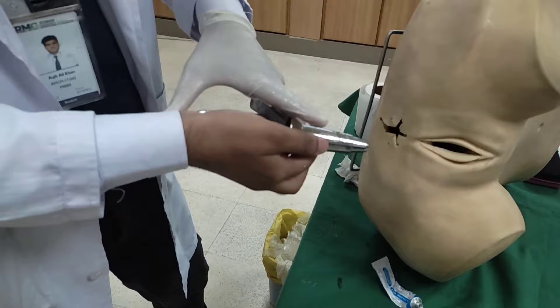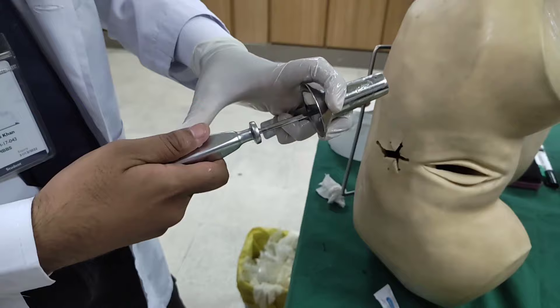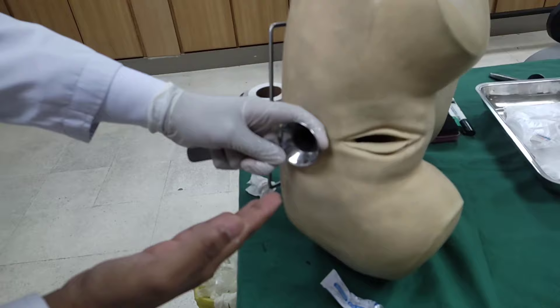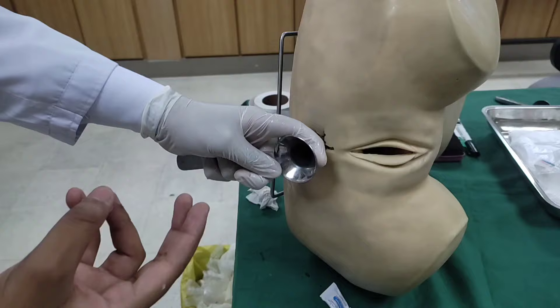Now what are we going to do properly? We are going to hold it like this so that we don't slip and damage the mucosa. We basically go from the 12 o'clock direction down to 6, insert it, then remove the obturator. We need to have a proper light source. We will look in this direction and remove it slowly. If there is a hemorrhoid or a swelling, we will see it on the back side.